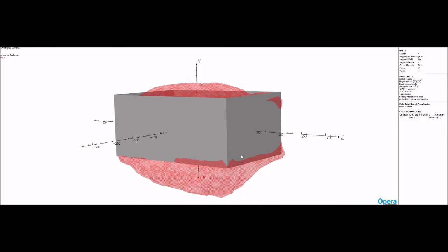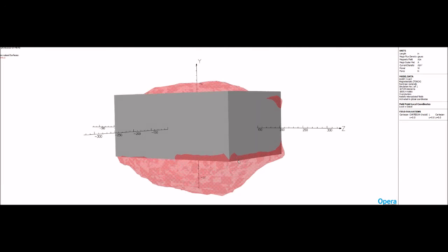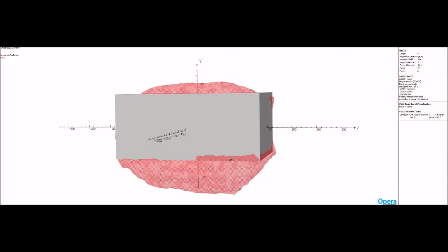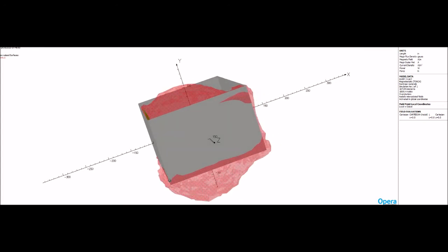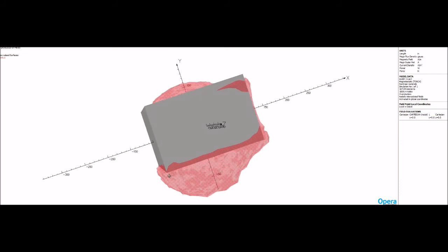This can be eliminated as well, but would require a substantial amount of steel in other areas. You can see that on the sidewall as well at the bottom. The 5 Gauss line is still trying to come up a little bit. It's just a couple inches outside the wall and a couple inches from the ground level.